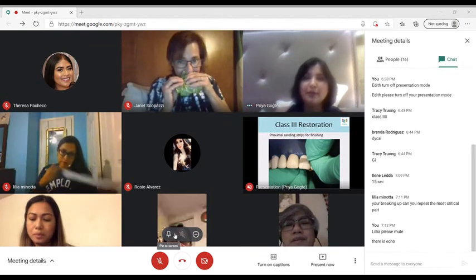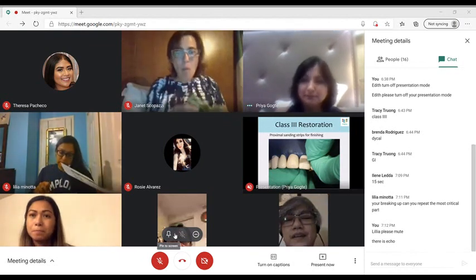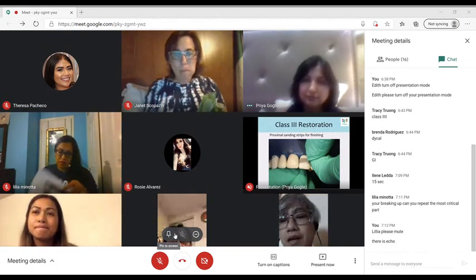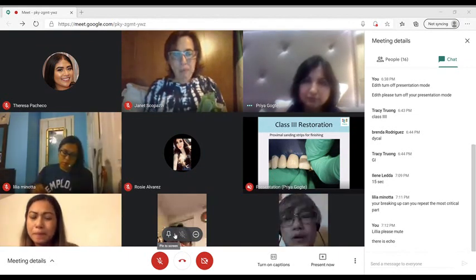Question, doctor. Yes. Even though you have a liner or a base, do you still put flowable?